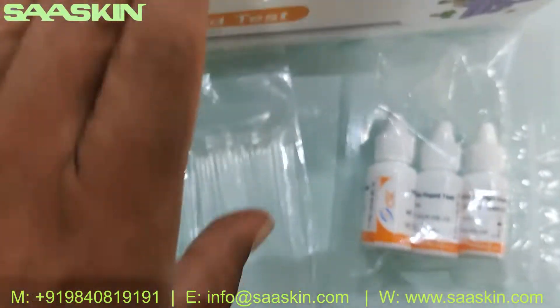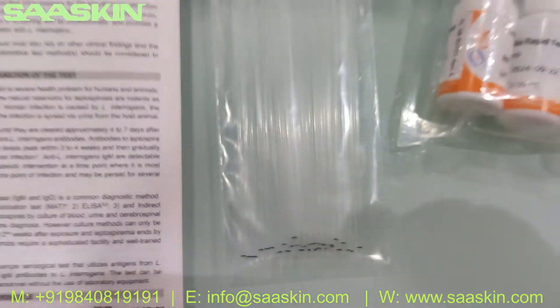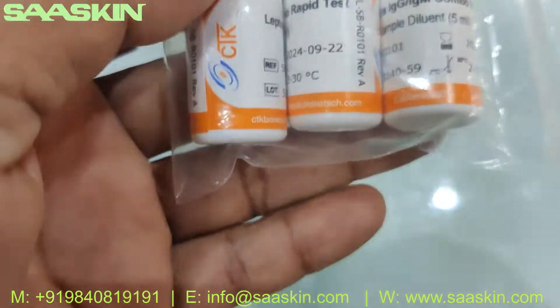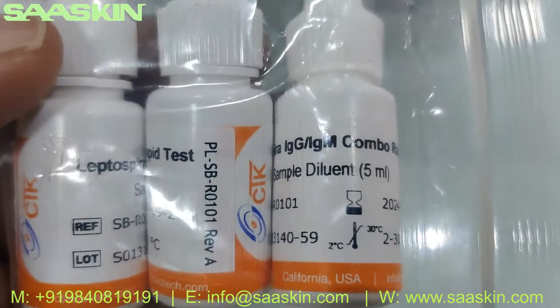So this is a 30-test kit box with 30 test cassettes. And you get 30 capillary tubes — I was initially saying 25, but it is actually 30 capillary tubes. And 3 bottles of buffer liquid, so in total you get 15 ml, each 5 ml.